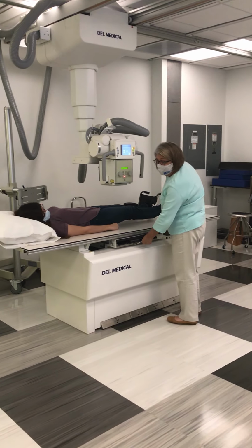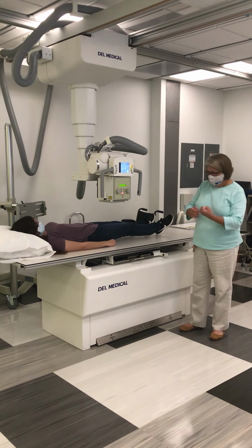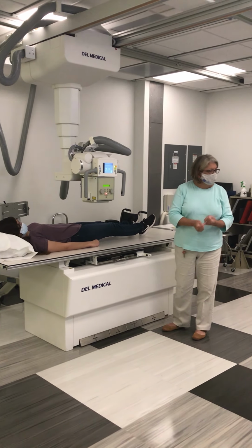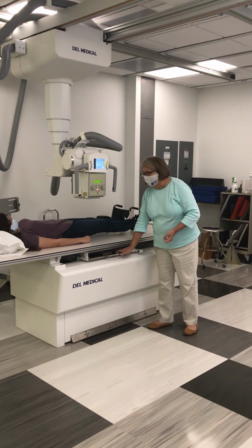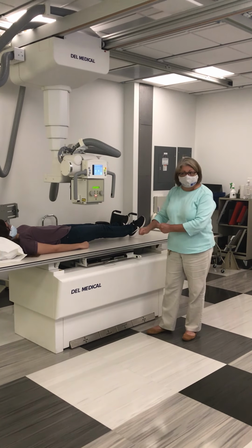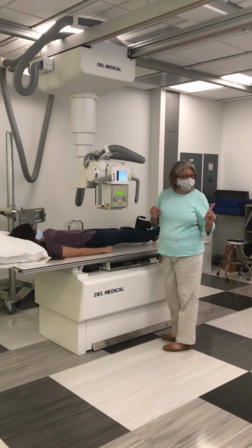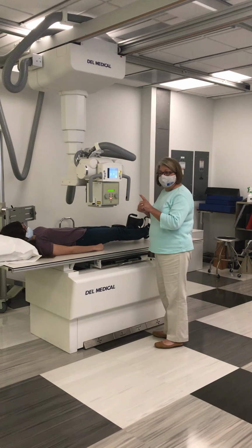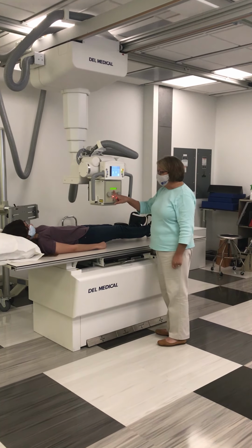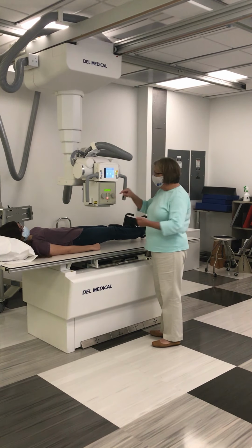I close the bucky tray firmly. And again, to get accurate readouts, you have to have your image receptor seated properly in the bucky tray, and you have to have that bucky tray closed firmly. The last thing I set is my SID. I'm going to look at the readout to achieve that. And my SID is 40 inches.